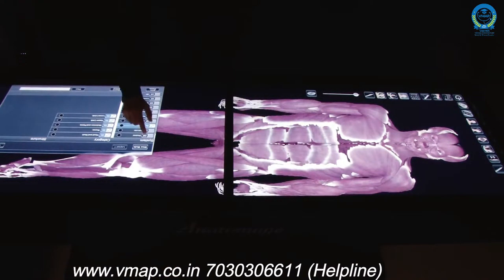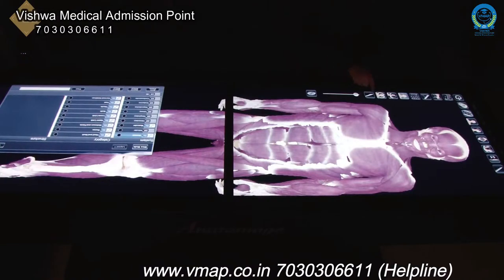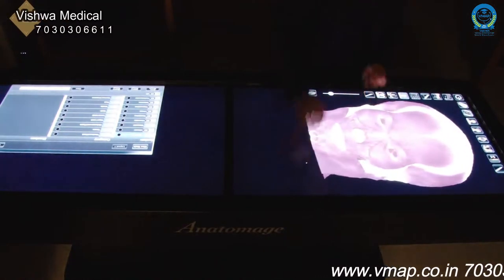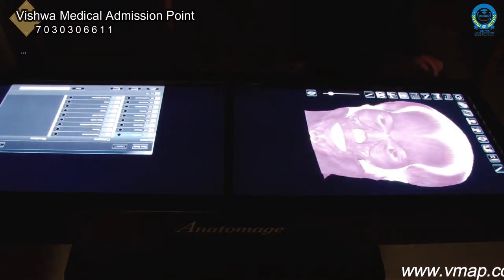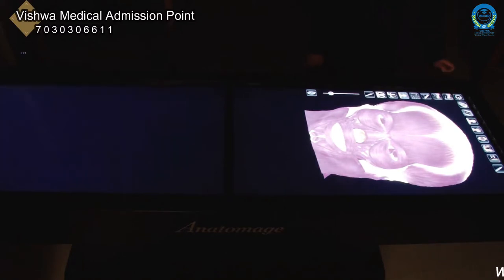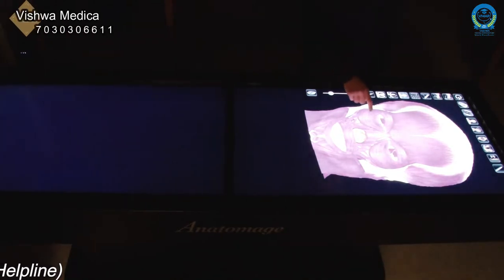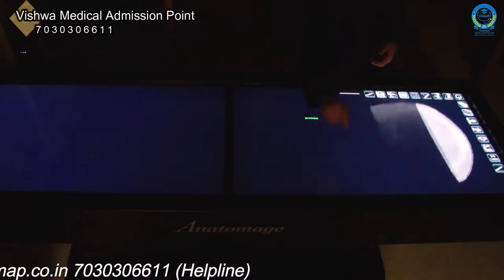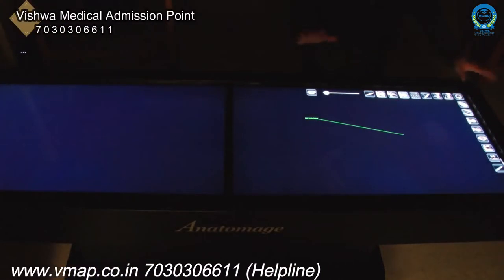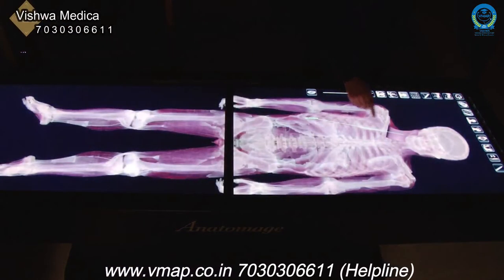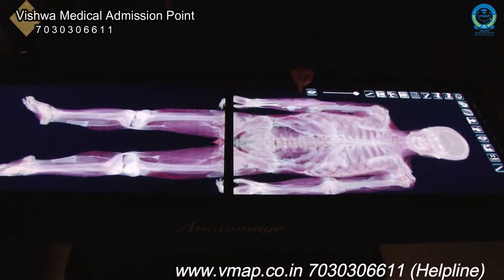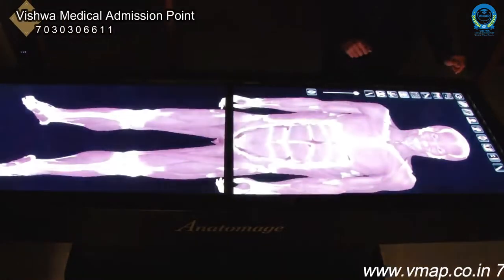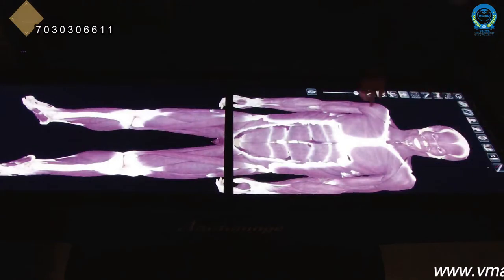Even a human cadaver does not allow students to do this type of study. With the Anatomage Table, students can isolate individual muscles, bones, or structures, and enlarge areas of the body in high-resolution scans to see them very closely. They are able to annotate structures for quizzes and self-study, and individually ghost image a structure relative to other structures, as you see here. The table will also identify those structures for the student if they are having trouble.